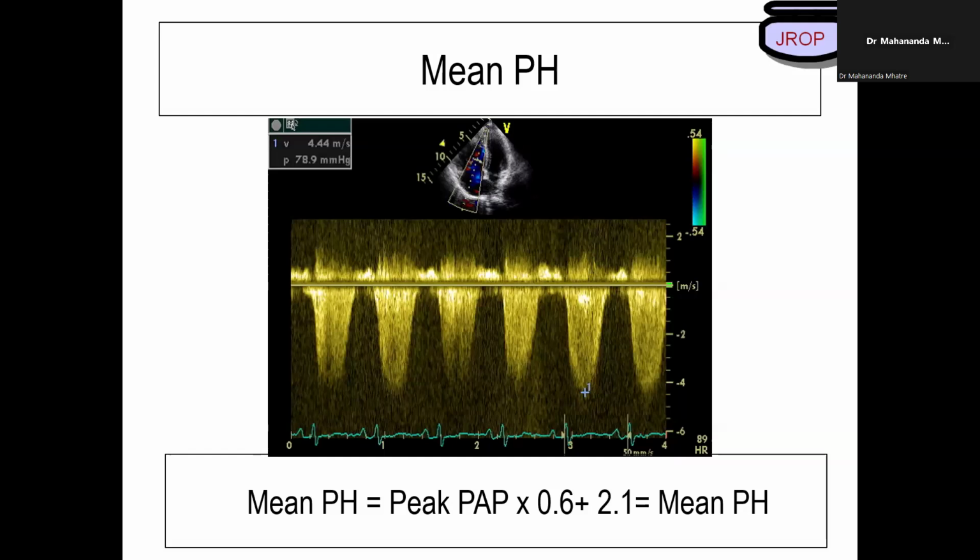Usually, sir, while doing 2D echo, I get TAPSE and RV free wall TDI easily. TR-jet, whenever it is severe, I get it, but a normal small TR-jet, I don't get. Matre, you have to do it in all. I don't say do it in every patient, but wherever you suspect a patient of COPD or right-sided cardiomyopathies or valvular lesions, use all 5 windows which I've told you.